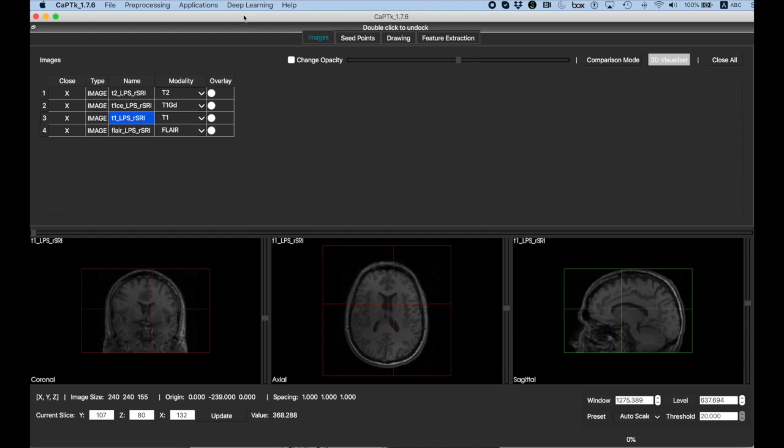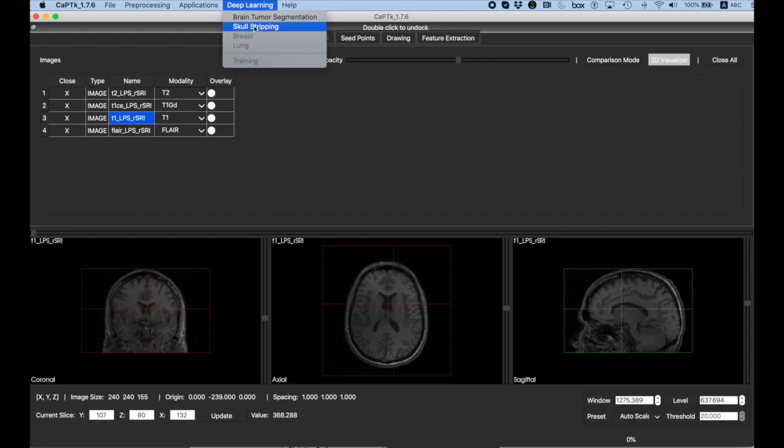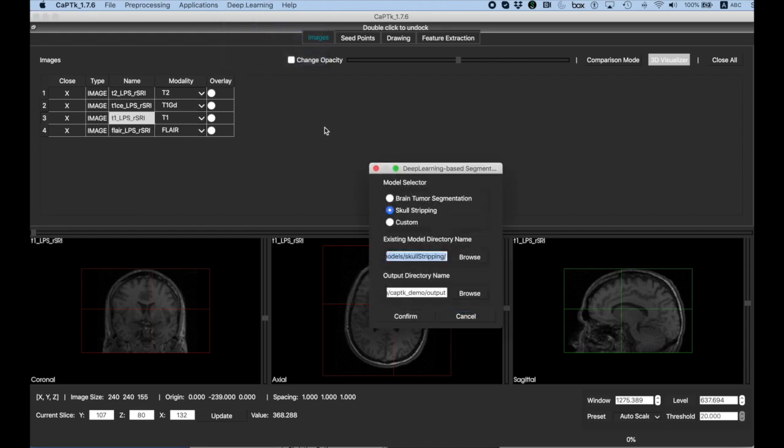To obtain a brain mask, we're going to deep learning, select skull stripping, and for the model, we're going to use the pre-trained model that comes with CapTk, which was trained on Penn subjects. The output directory goes here, and you hit confirm.